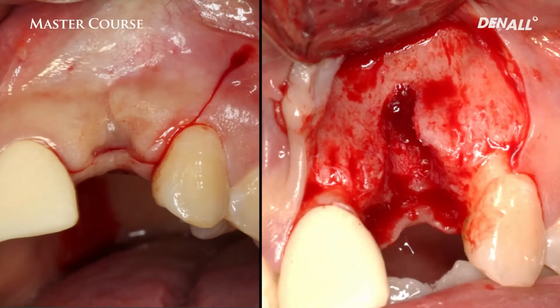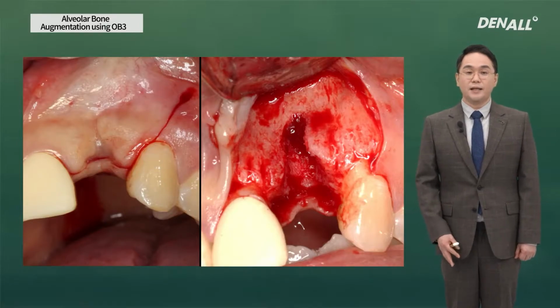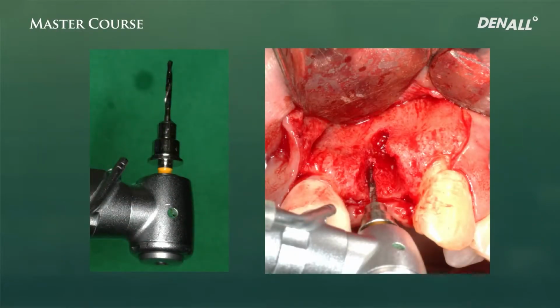The flap is opened, and in this patient, we can place an implant immediately, but the patient did not want it, so we decided to do bone regeneration first to make the contour. So we decided to place the tenting screws instead of implant and use a Jawbuilder. In the Builder kit, you can see the drills exclusively for tenting screws using the drilling. The drilling is done on a sound bone to get a primary stability. You don't have to drill full depth. The tip of the tenting screw is very sharp and designed for self-tapping, so drilling is to mark a point.